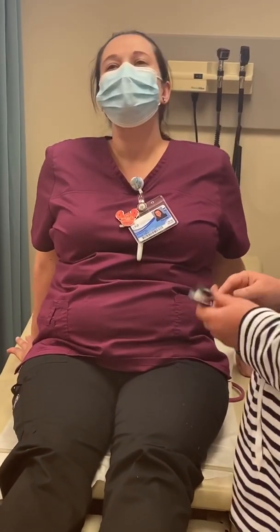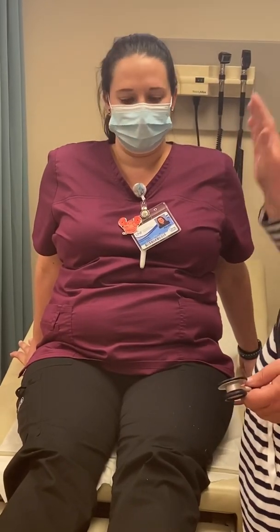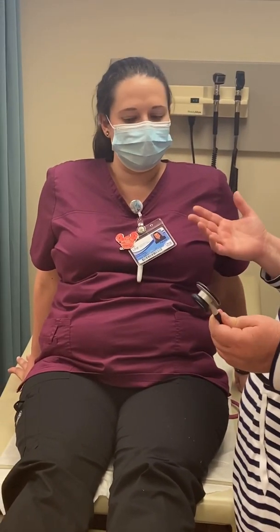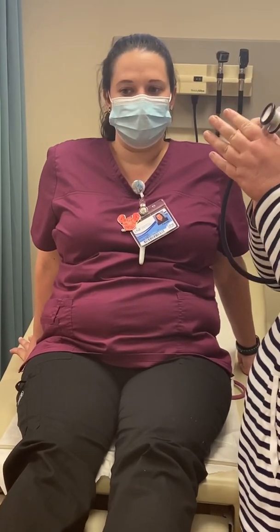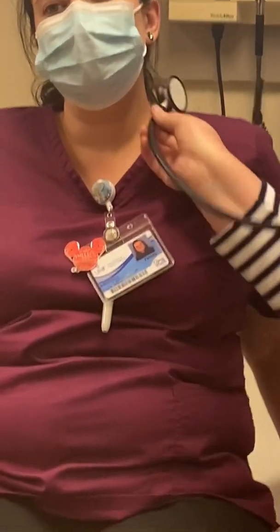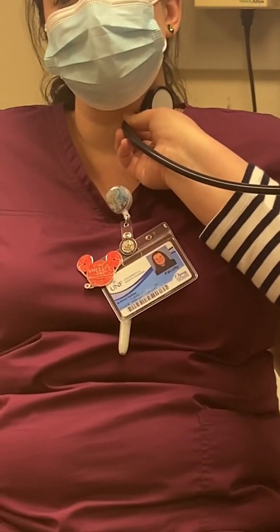Okay, so when we do our pulses, I always do my pulses and then come back with my stethoscope. Remember, when we're listening to the carotid, we're listening for a bruit, which is a narrowed vessel that has turbulent blood flow. So we palpate the pulse, put the stethoscope right here, and listen with the bell for turbulent blood flow.